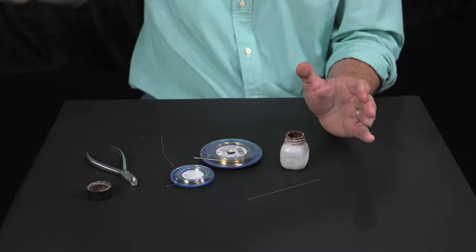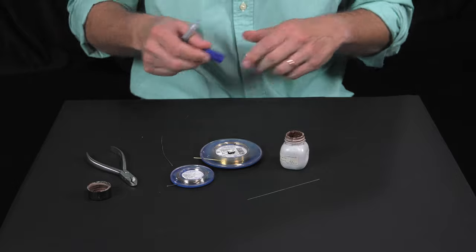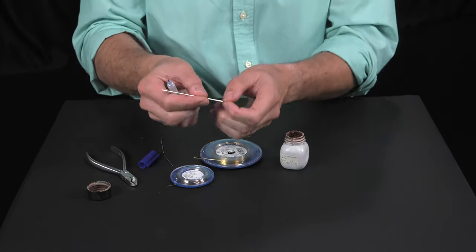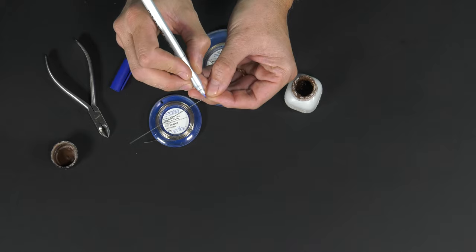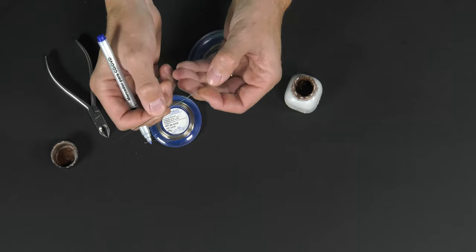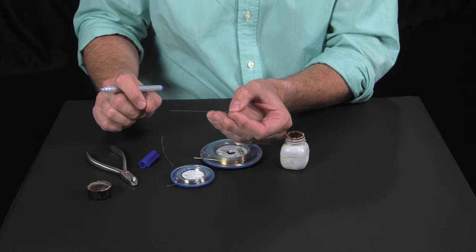First, we mark on the wire the point where we want to perform the soldering. In the mouth it would be distal to the central and lateral incisors.